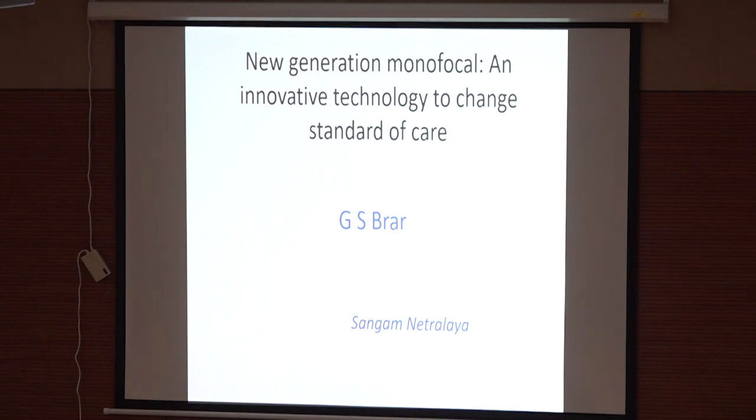So I'll actually be touching upon one particular IOL, not a host or a series of these newer generation IOLs. I'll be talking about my experience with the Technis Eyhance, which is a monofocal extended depth of focus lens. Some people may not consider it an extended depth of focus lens, but generally everybody realizes that the landing zone or the defocus curve is a little flatter than a standard monofocal.